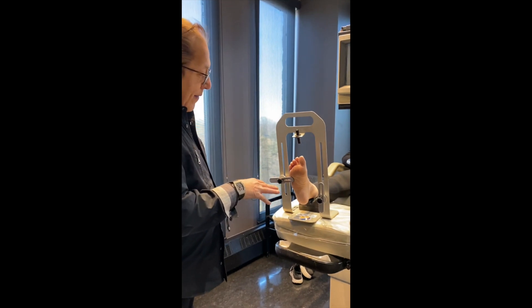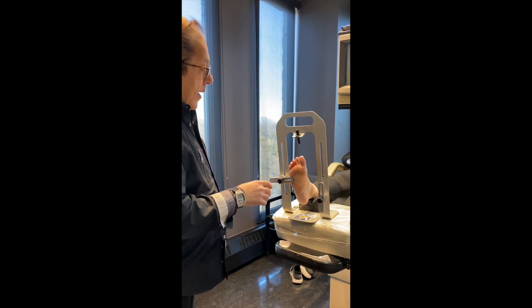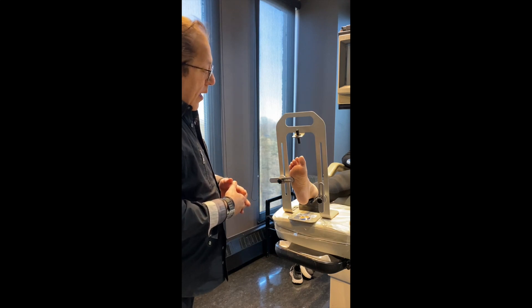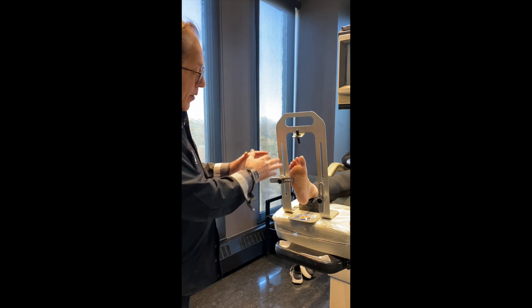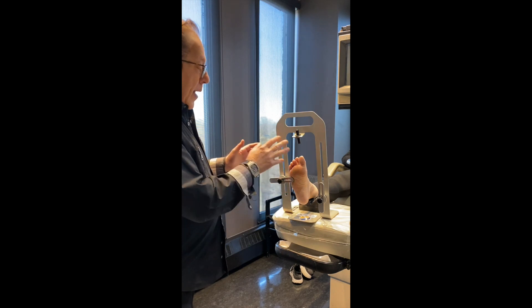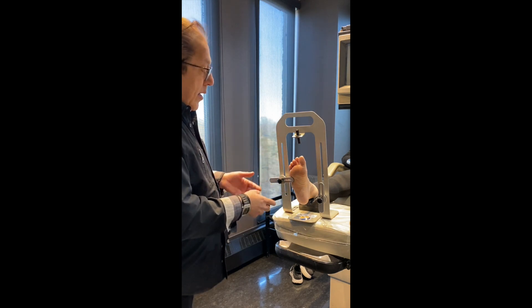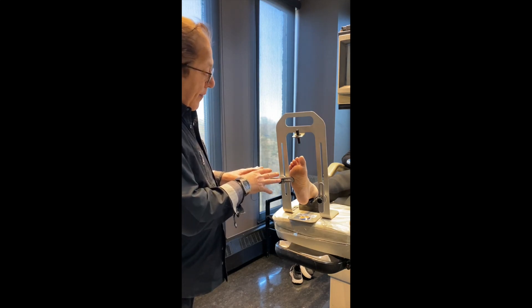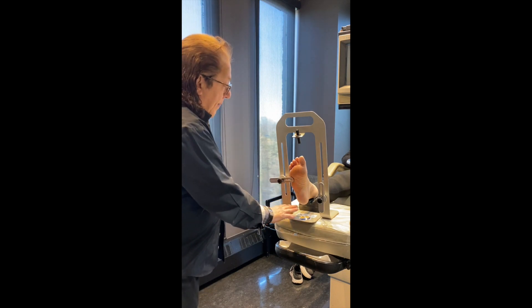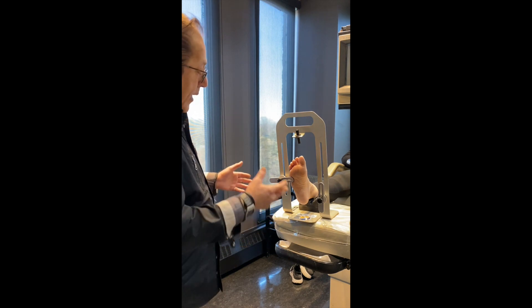This is a newer way of scanning for prescription orthotics. The gold standard, and what has been used historically, is the plaster of Paris casting where you take a mold of the foot. Some people still use foam boxes. We use a mini iPad, which I'll show you shortly, to take a scan of the foot. But I believe this unit here is new to Canada.